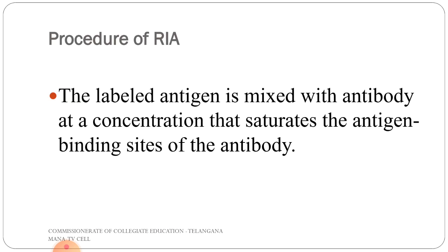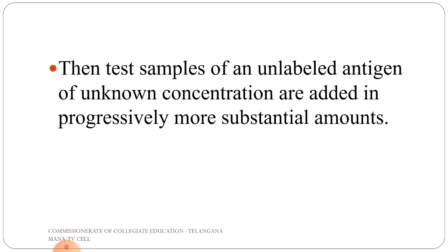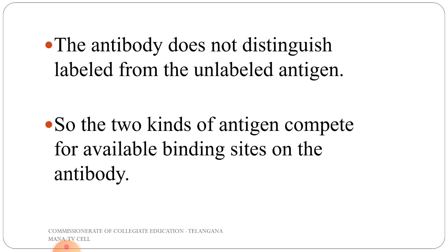Now let us see the procedure of radioimmunoassay. The labeled antigen is mixed with antibody at a concentration that saturates the antigen binding sites of the antibody. Then test sample of an unlabeled antigen of unknown concentration is added in progressively larger amounts.